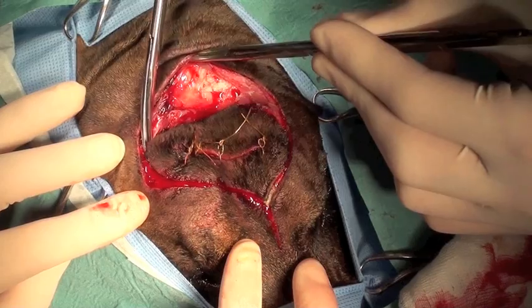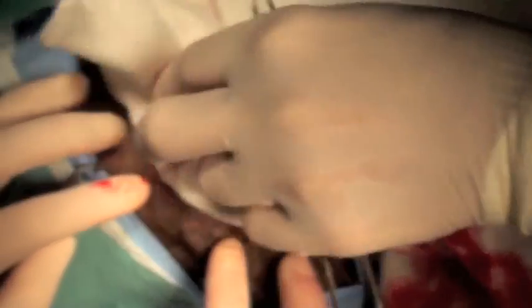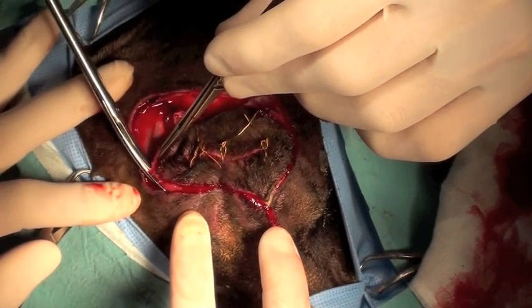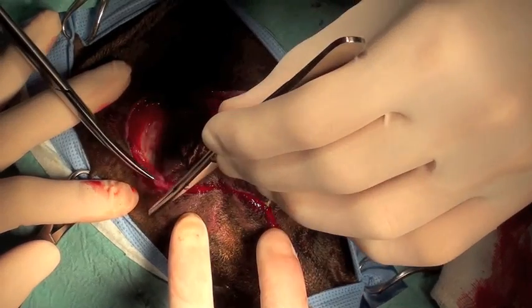We're dissecting further using Metzenbaum scissors, and then it's very important to use Gelpi retractors in order to retract soft tissues out of the way and facilitate the exposure.